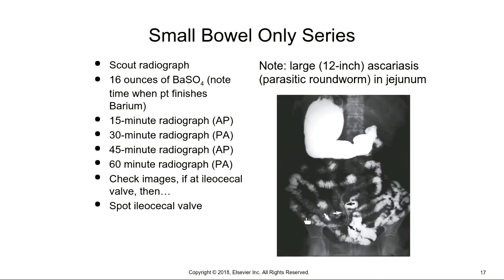Just to share with you, I had a patient once that had slow motility, and we started doing the small bowel. When we got done with the 60-minute, the radiologist asked for an image in another hour. I had done that. It really hadn't moved. So the radiologist told me to let the patient go down to the cafeteria, have breakfast, have coffee, try and help move things along, and then bring them back up. When I brought him back up and did that image, it still hadn't really moved. So the doctor actually told me to let the patient go home and have him return. It ended up being like an 8-hour image.